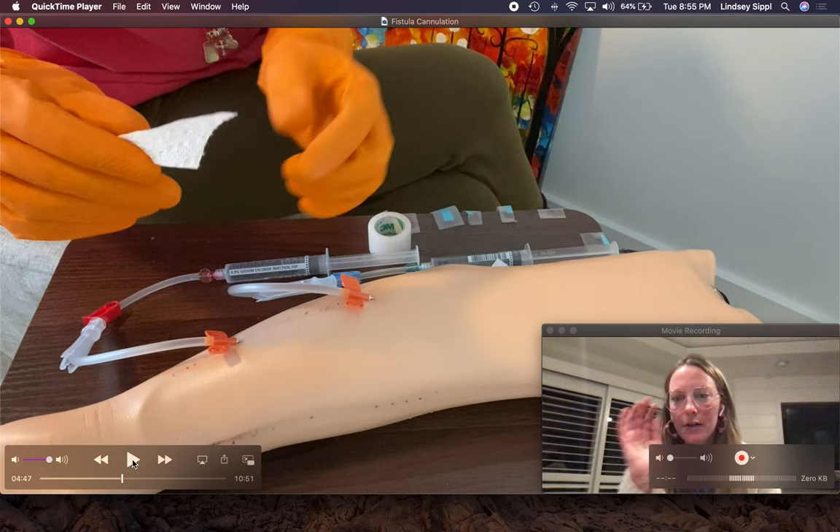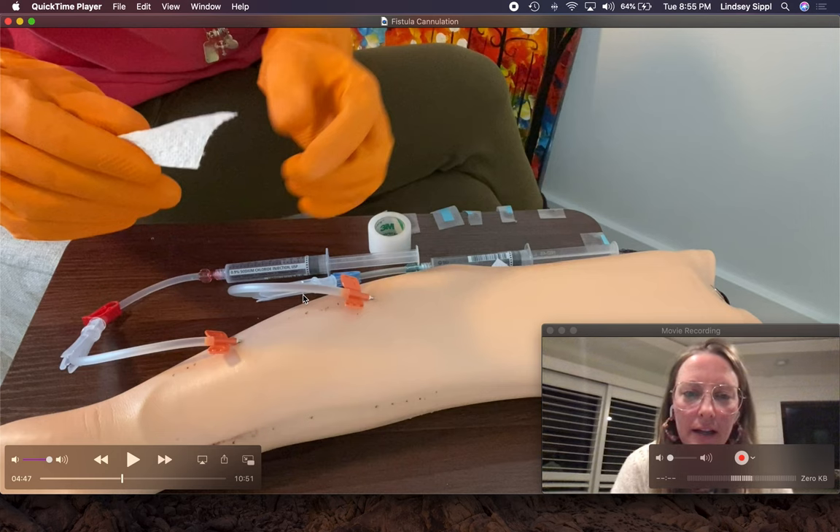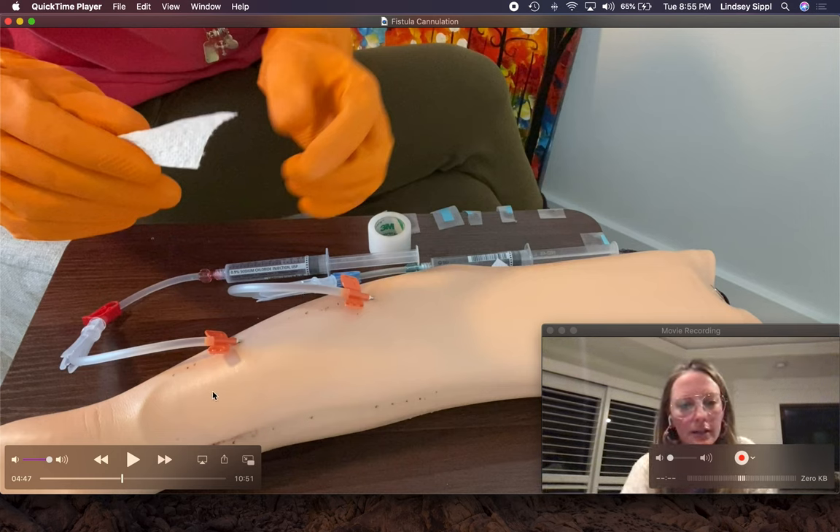We hooked them up to treatment. They had a great flight. Three hours have come and gone and they are done with dialysis. We are ready to take their needles out.